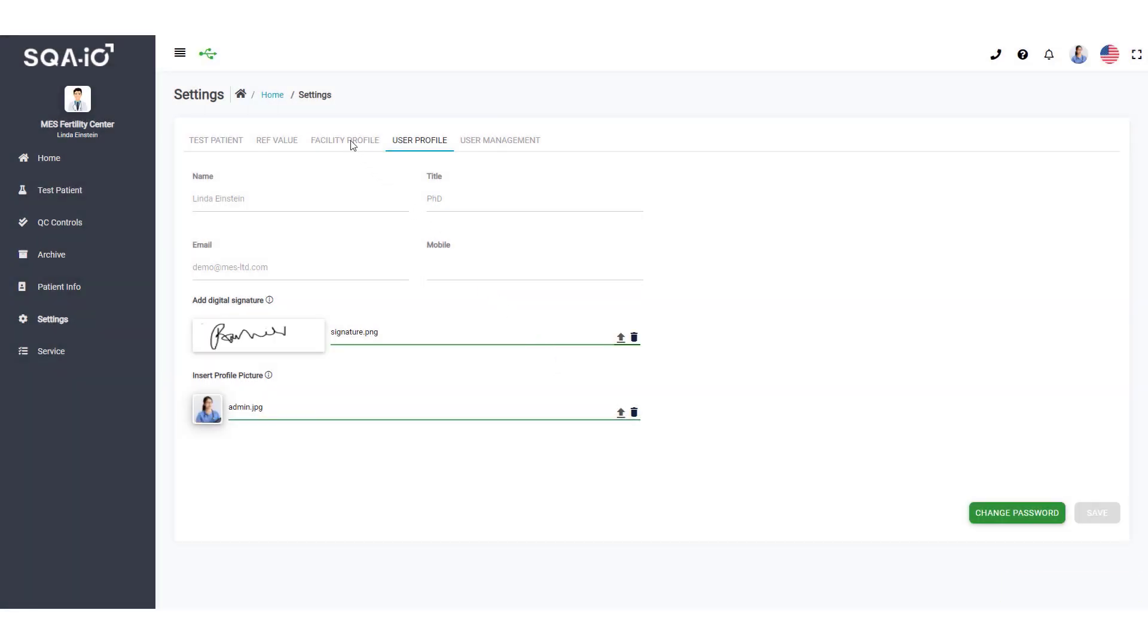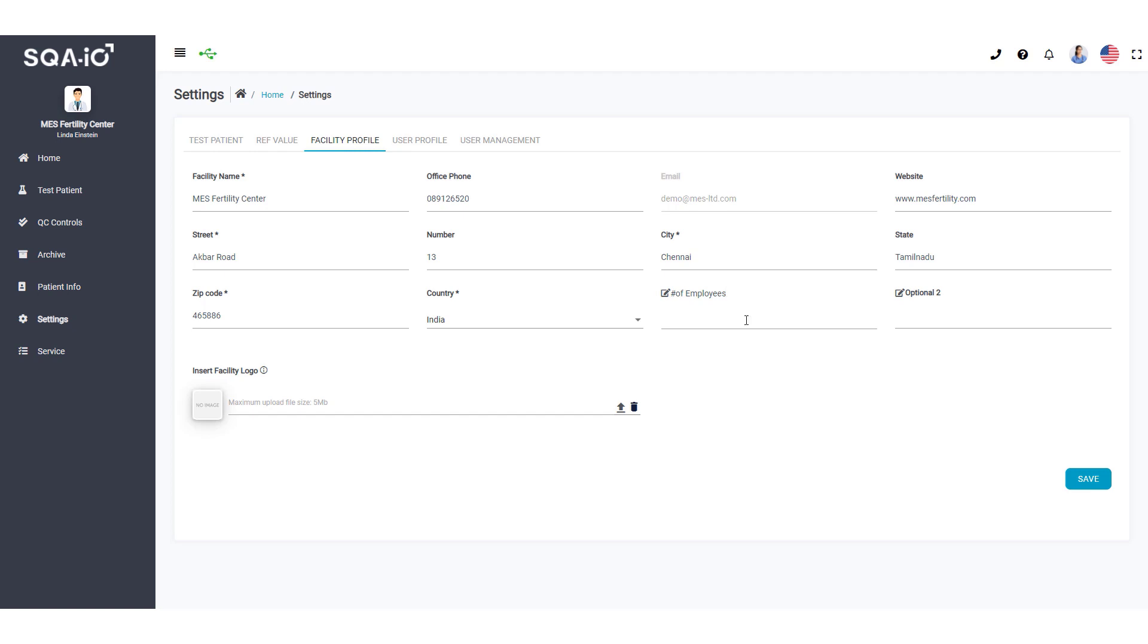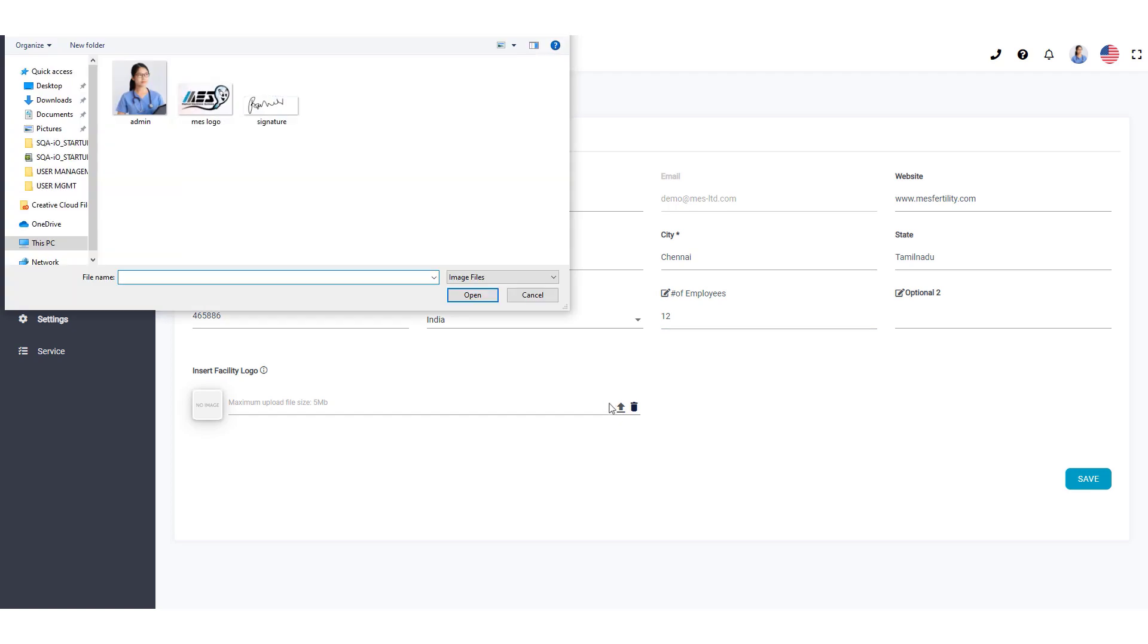Click Facility Profile to add or change company information. Define the titles of the Test Report optional fields here. Add your facility logo here and it will appear on the semen analysis report.